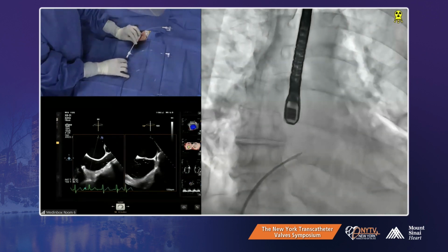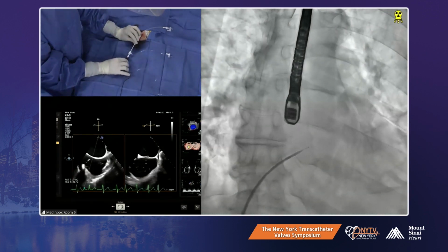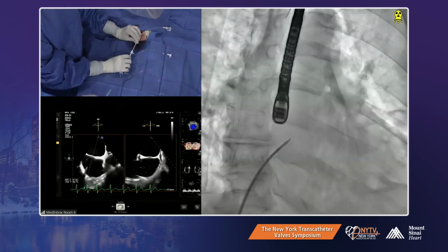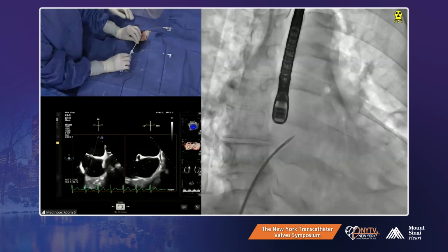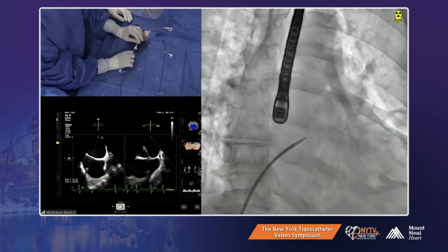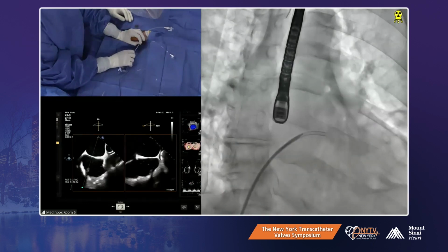Since they are ready for the transseptal, as soon as they are done, then we'll have enough time before they get to the device. Yes, because that's a very important point which Roxana asked. Everybody wants to know that. We can do that anytime.